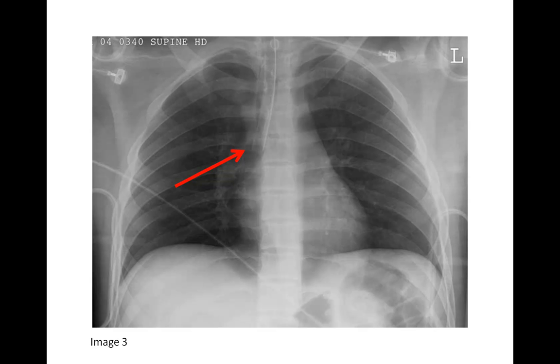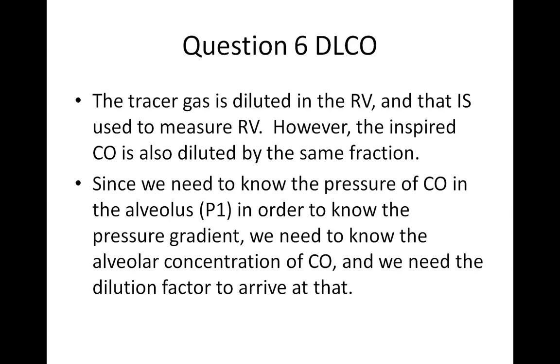The last one of my items that people seemed to miss points on was number 6. It was the DLCO question, and it really asks, what's the purpose of the tracer gas when you're doing a DL maneuver? Remember, the key words in here are that we're doing DLCO. So that's the test. It's not a helium dilution FRC measurement.